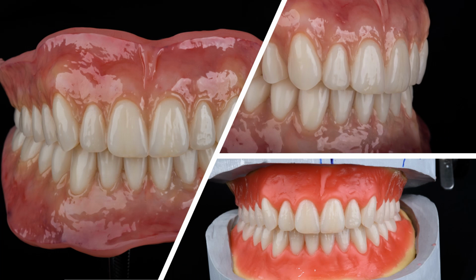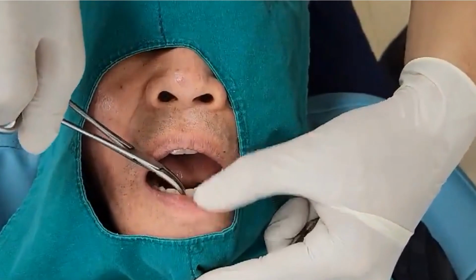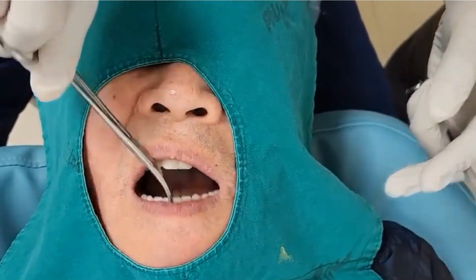With fine adjustment for any overextensions or undercuts, you can deliver a well-fitted, aesthetically pleasing, and stable denture. With occlusion adjustments, we can ensure bilateral balanced occlusion in lateral movements. As you can see, this denture does not come out easily.